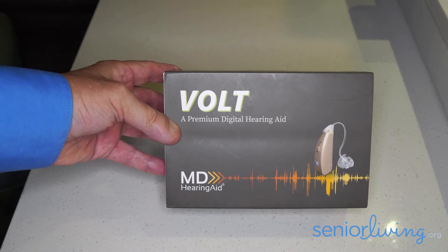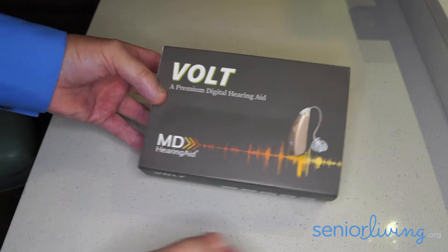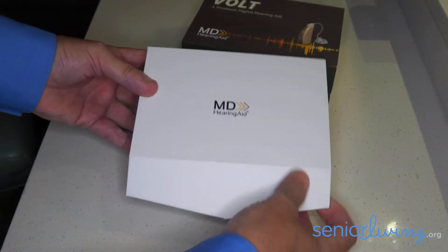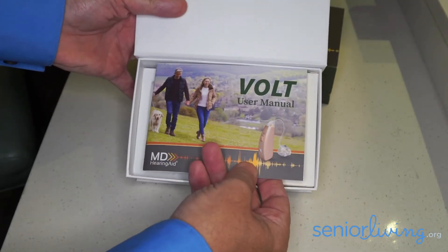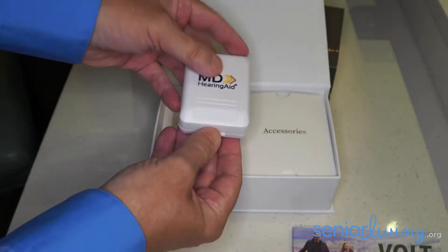This is the unboxing of the mdhearingaids.com Volt hearing aid. The Volt comes in a nice magnetic clasp box. Inside you're going to find a user manual and the Volt hearing aids over here are on the left side.